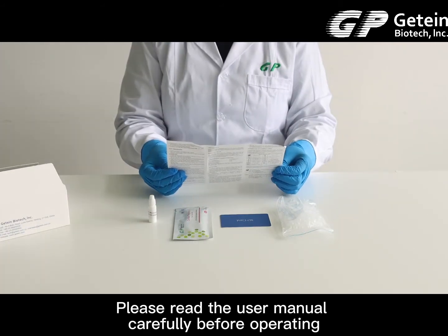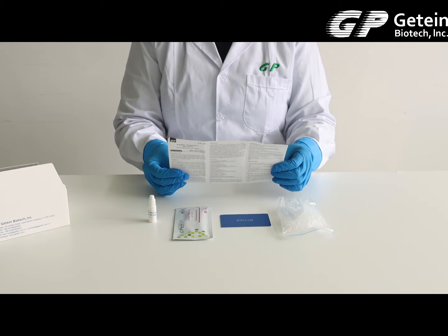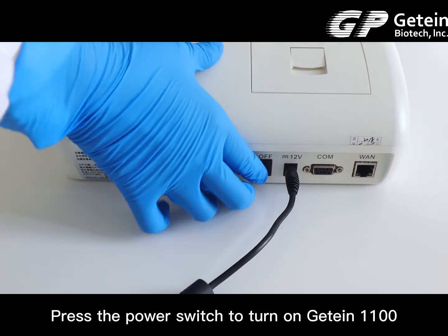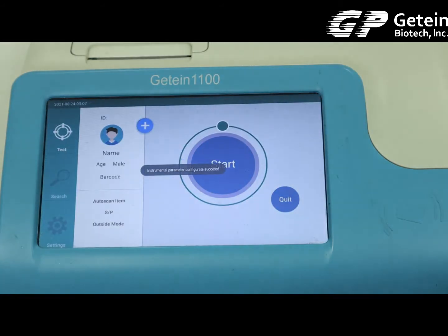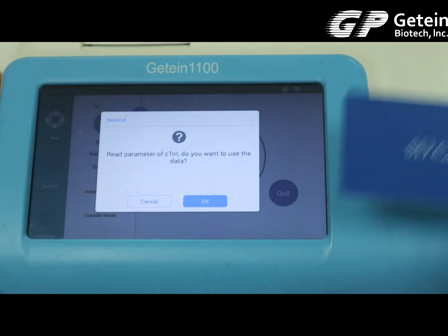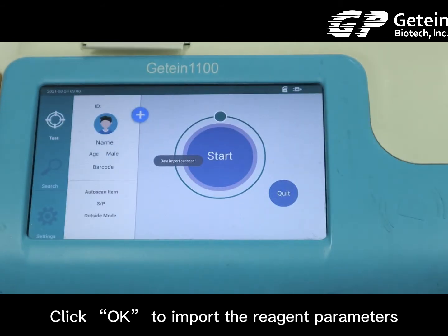Please read the user manual carefully before operating. Press the power switch to turn on Getein 1100, then click OK to import the reagent parameters.